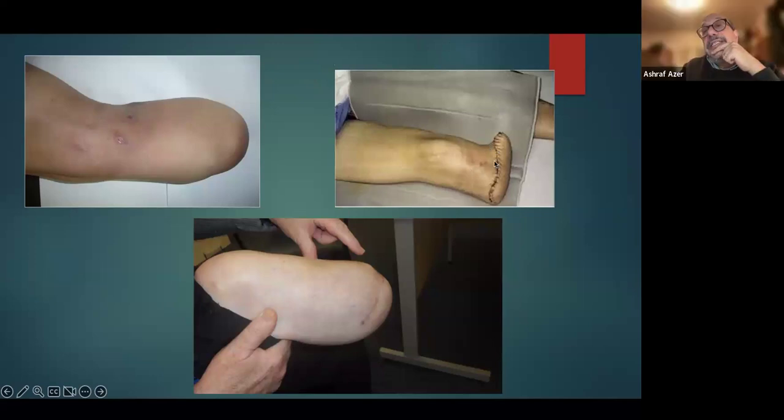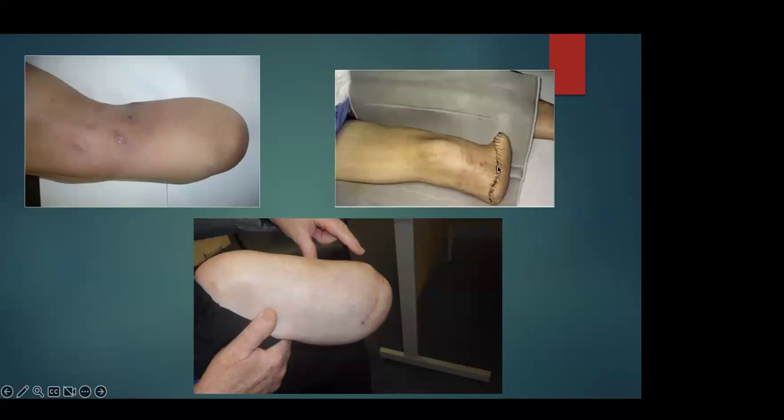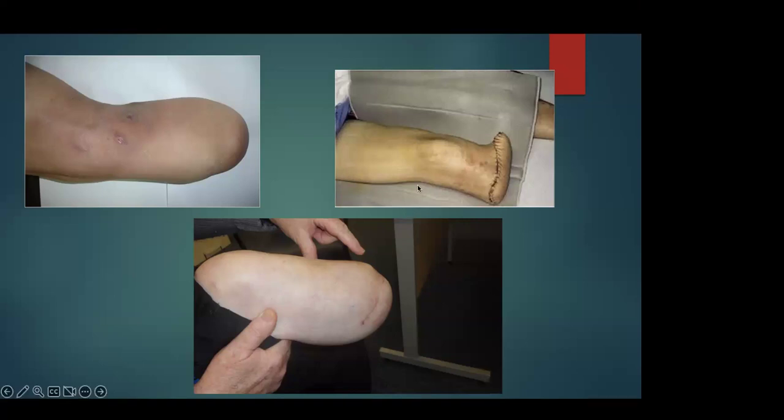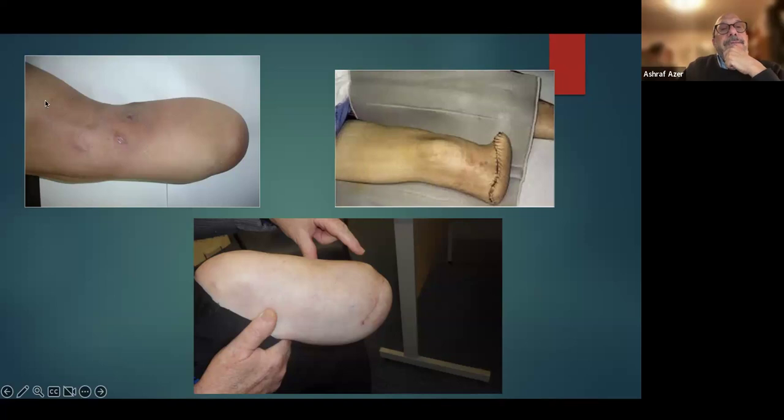And also, he did not do the lengthwise try, because see how short it is? Yes, it's very short. He left a big chunk of muscle and closed over it. Once it closed, it left this big problem. Imagine you put this in a socket. I'll show you the socket in a minute. This will go ischemic straight away, especially in diabetics.